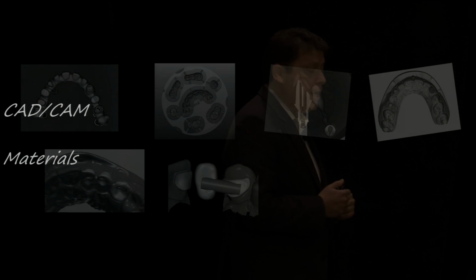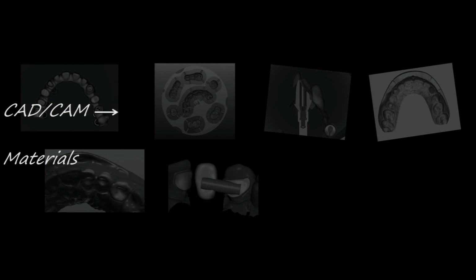And certainly, as CAD/CAM technology evolves, and it's truly an evolution, we have the opportunity to harness the new developments with CAD/CAM technology and marry them with the new materials that we have. So today, we have the option to enhance the design of our restorations in the context of coping design for a crown or a framework for a bridge, and also for monolithic restorations.